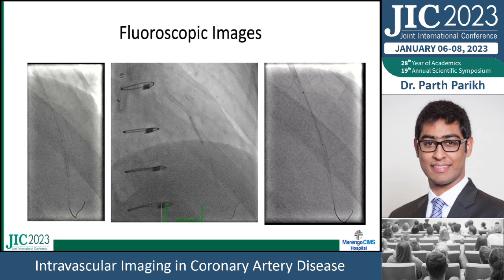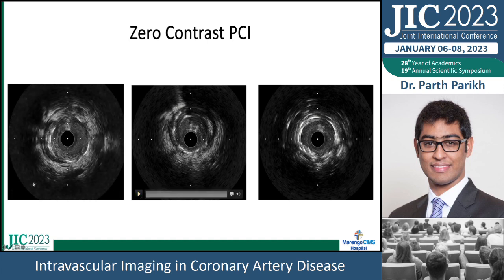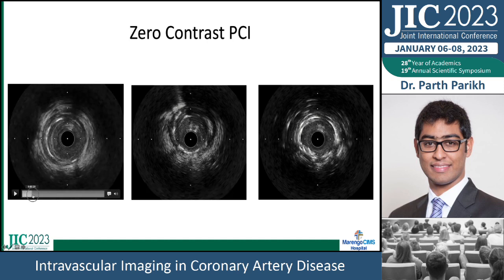Obviously, you don't want to use OCT because the creatinine is not normal, and we were able to balloon dilate just based on IVUS imaging, finding out where the lesion is, place a new stent based on fluoroscopic images, and end up with a nice result, which I'll show you on IVUS. So this is the pre-PCI IVUS, just looking at the lesion itself.